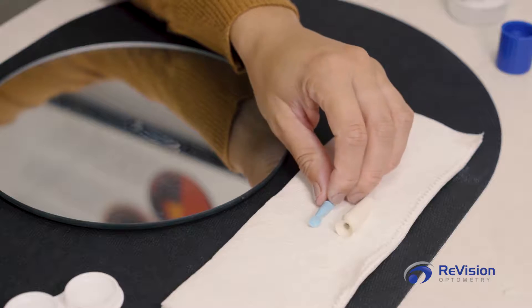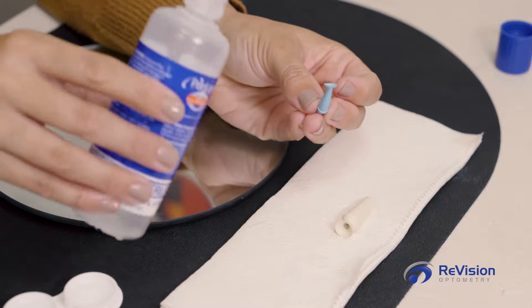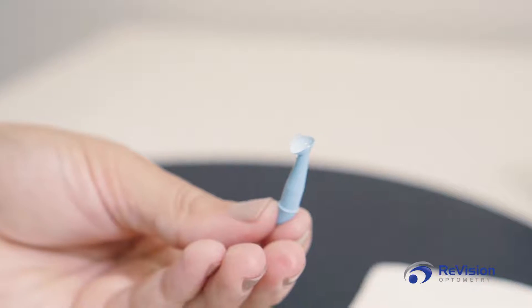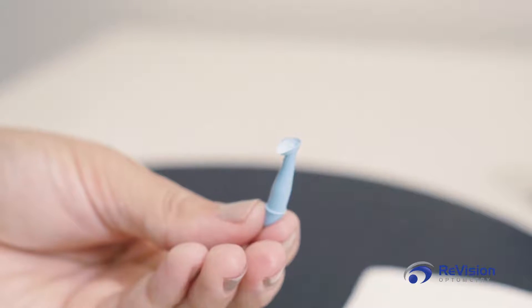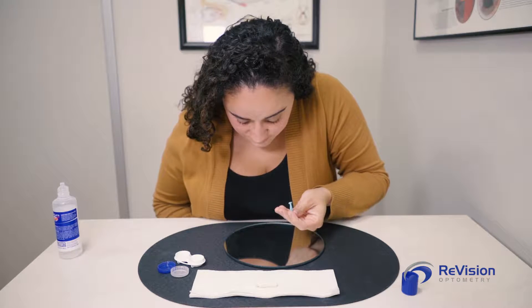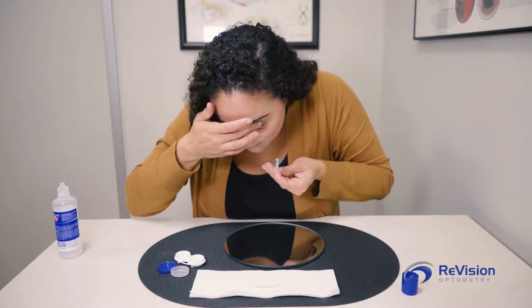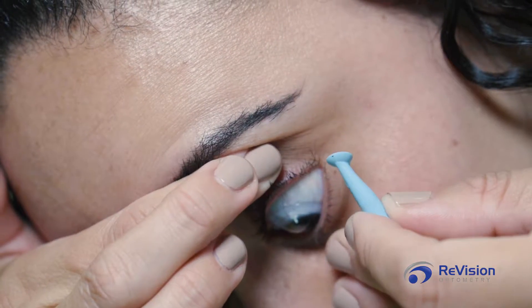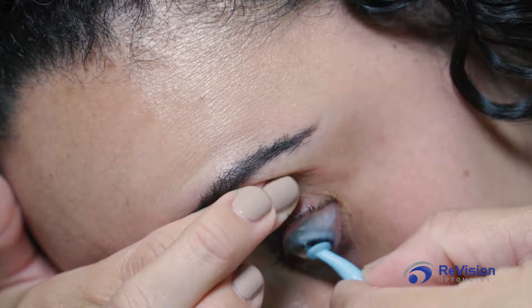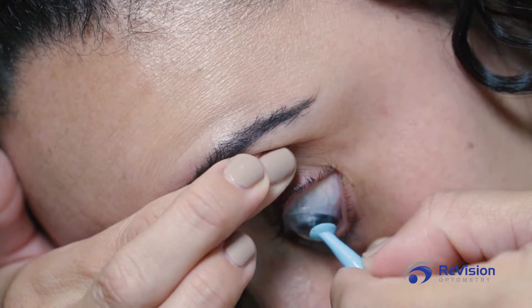To remove your sclerals, take the smaller 45-degree angled plunger and rinse the tip of it for a suction-like effect. Hold the plunger the same way you would when applying the scleral lens and look at the mirror. Use the fingers available to pull the lower eyelid down. Gently place the plunger on the scleral below the center of your cornea, just enough for the plunger to fully sit on the lens — remember to follow the contour of the plunger. Lightly press on the scleral and pull away from the eye, releasing the fingers holding your lower eyelid open.